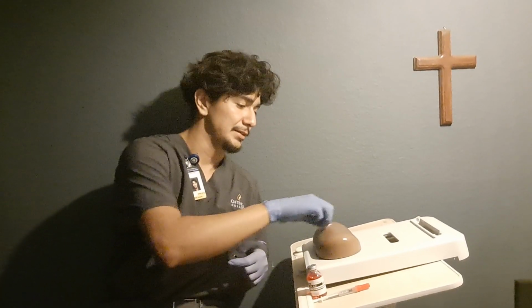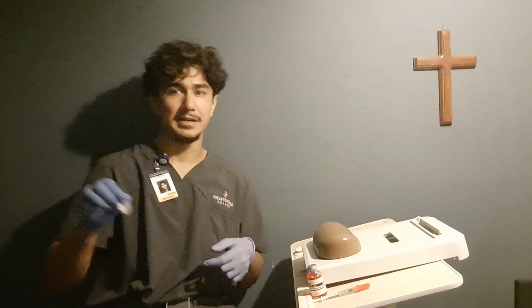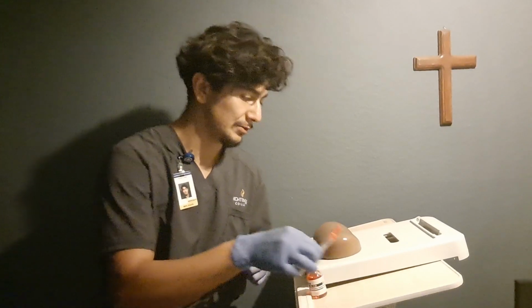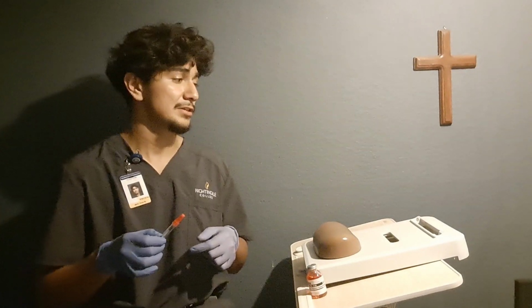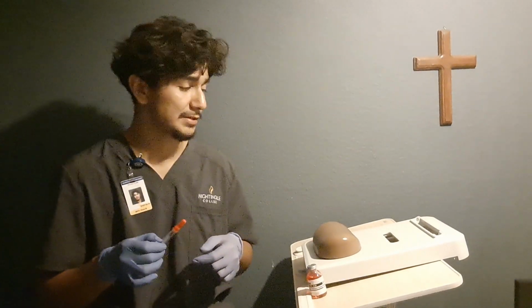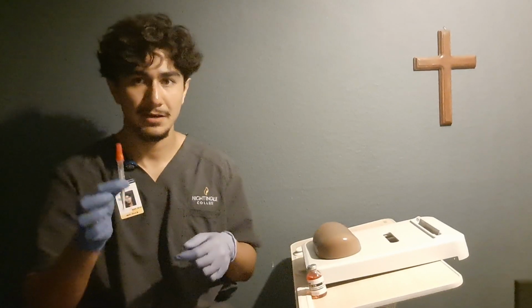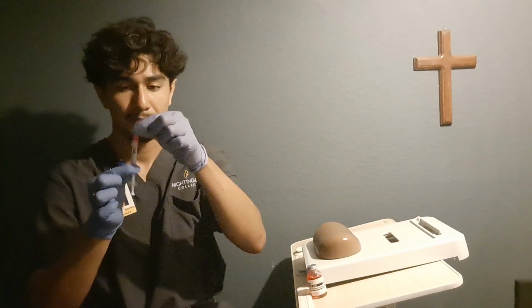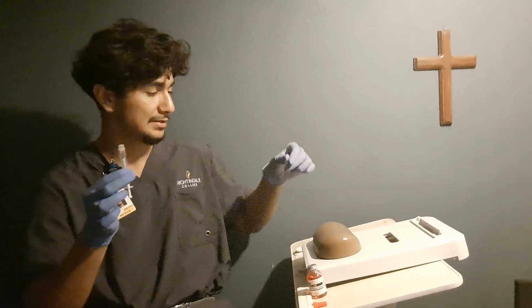So working our way out. Now dispose of that into the trash. Okay. Now we're going to go ahead and remind the patient, Mr. Victor, upon administration, you're going to feel some stinging and some swelling will occur. Okay, so now we're gonna go ahead and uncap our needle, and we're not gonna touch the site that we just cleaned.